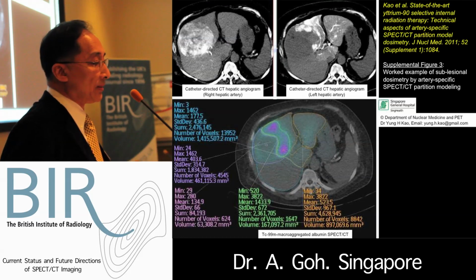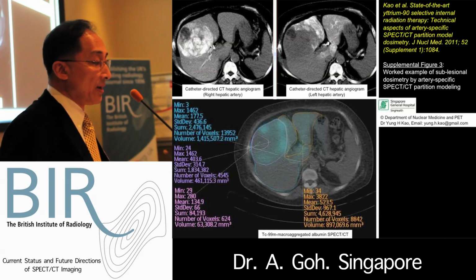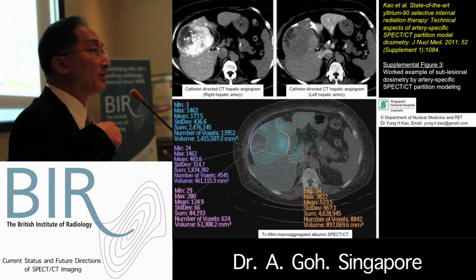And so these numbers, the counts, the mass of each tumor and of healthy liver, are plugged into the dosimetry worksheet. And it's a very long worksheet, and actually you can find this on our departmental website.